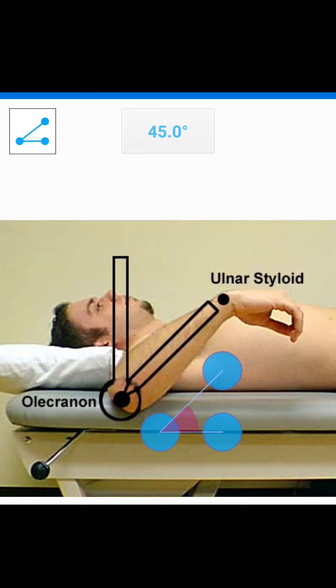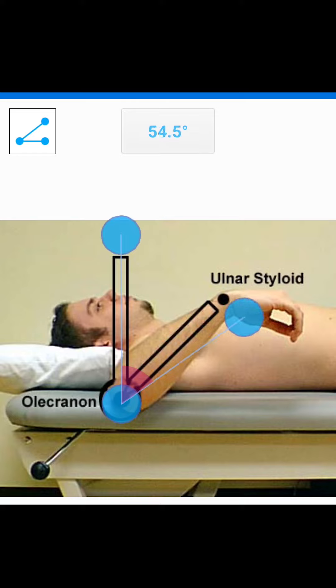I've pulled up another image here, and this one's going to be easier to use because the goniometer is placed in the same places that I'm going to place my protractor app. So I'm going to place the fulcrum over the lateral olecranon process. This one goes straight up, and then the movement arm is going to go in line with the styloid process. And I've got about 44.6 degrees of shoulder internal rotation here.